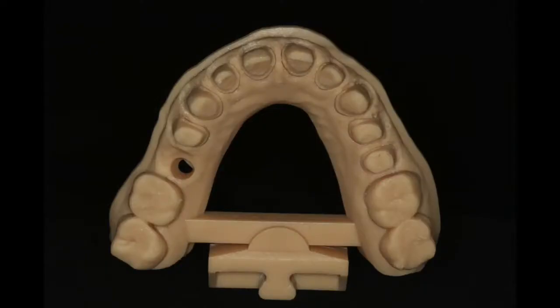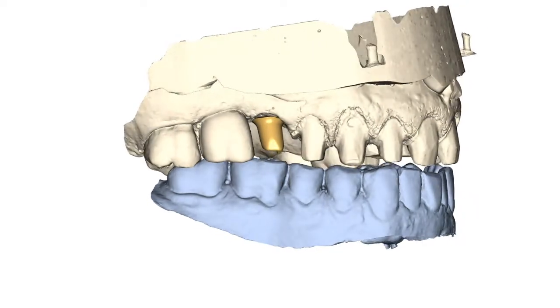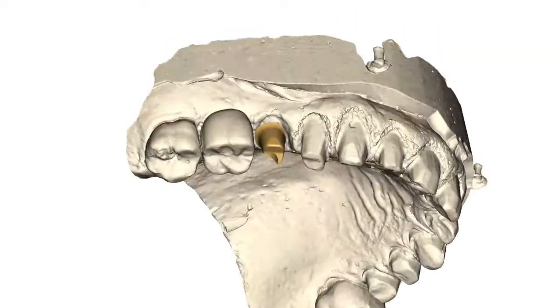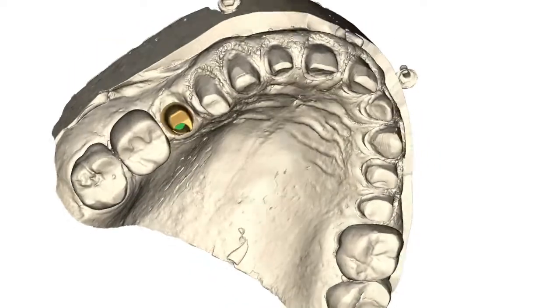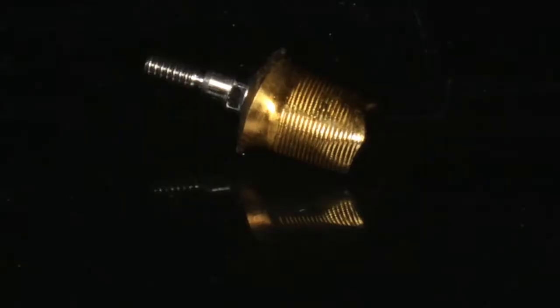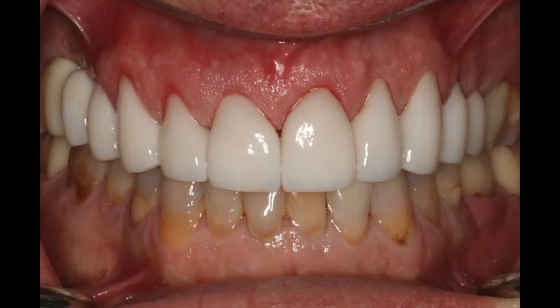You can get 3D printed models. This is the Atlantis abutment, which was a gold hue titanium abutment. This is the final restoration, and the day of insertion.